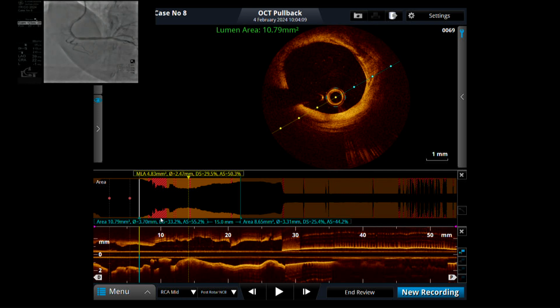I will always think of the safety of the patient, and I will not like to make it picture perfect at times, because in this patient if you create a big perforation, fine, we have Papyrus available in the lab. Unnecessarily we are doing a lot of disservice to the patient. So let me see, and I will give you some sound reason for doing it or not doing it.